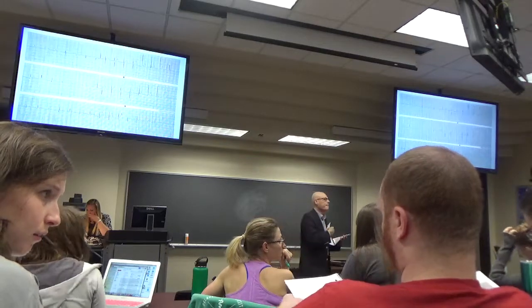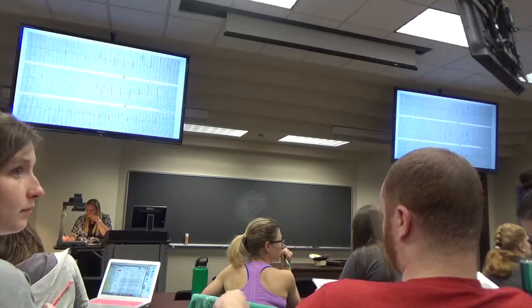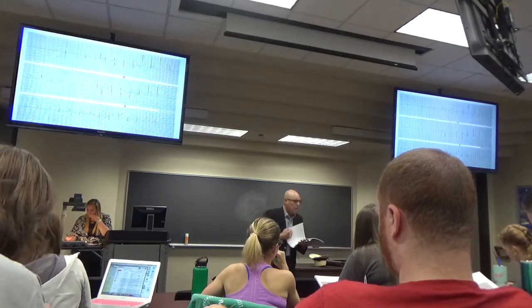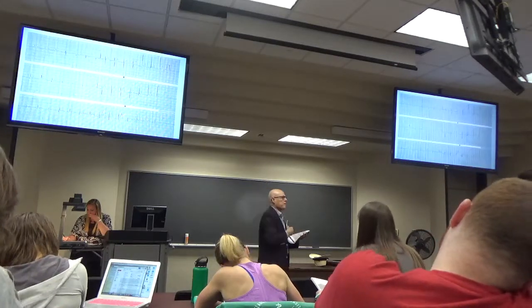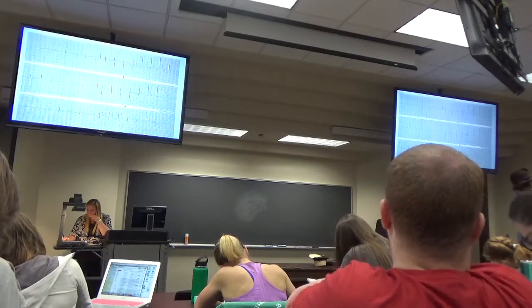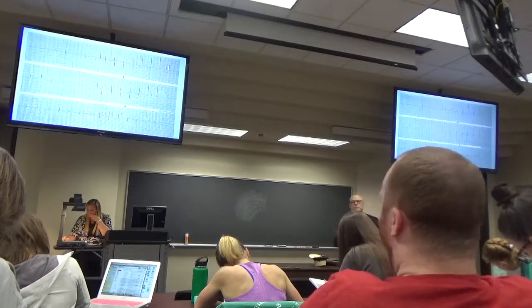So with the T waves that are peaked, I just put a primary T wave change. Does it have to be upside down for it to be a primary T wave change? No. If they're peaked T waves, that is a primary T wave change. But I would call it peaked T waves because they mean something different than inverted T waves.